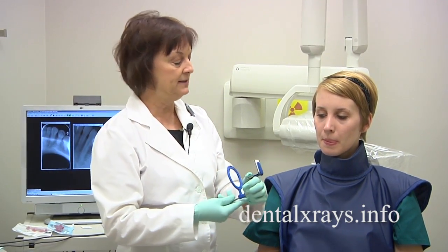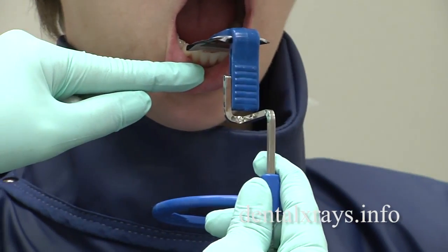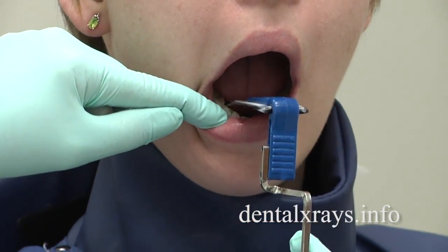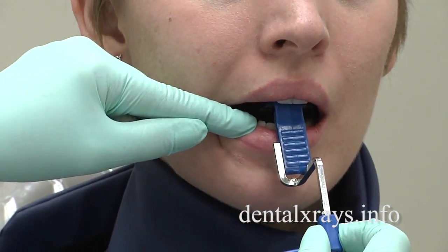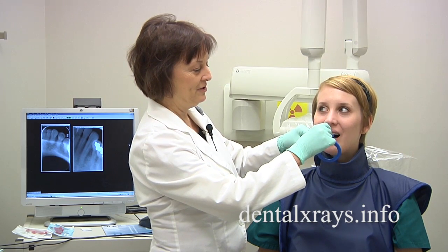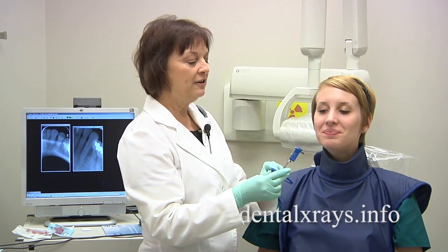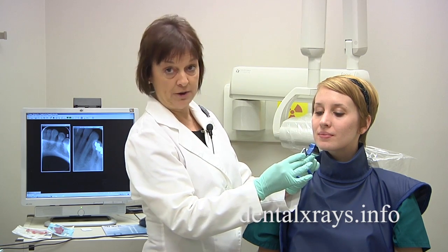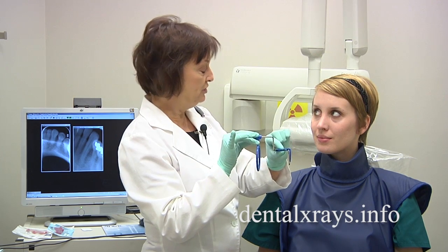I'm going to show you how much easier it is to place the size 1 film. The bottom edge can actually be placed a little bit closer to the teeth behind them. She's still quite narrow, so I still have to go quite a ways back. Before she bites, roll it up and then close — see how that works a little better. A good idea is to explain to the patient what you want them to do before you place it, so they know what to expect.